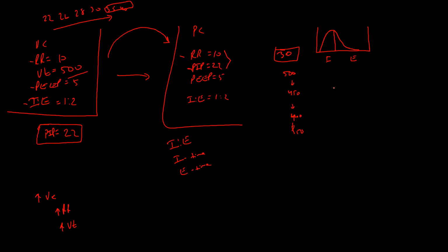If you have a COPD patient, it needs to be more like this. 1 part inspiratory, so let's say 4 parts expiratory or so. When you get into an ARDS patient, it's more like this. You want to go in slow, and then they exhale fast.